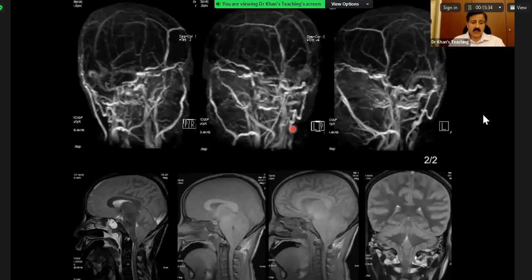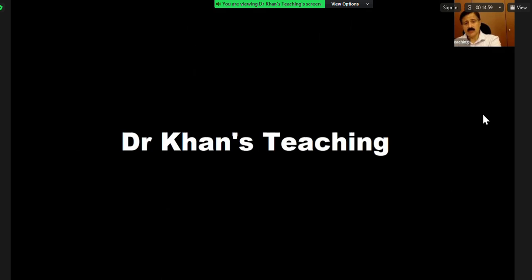Please remember that various countries have various types of legislation, and in brain death usually imaging is not done, but at times imaging is asked for. And the main concept is that when there is no intracranial blood supply, or the internal carotid artery is not supplying any blood, then you can call it brain death. You can use PET scan, SPECT, you can use MR, CTA, DSA for this. But this concept has been asked in the exam again and again.